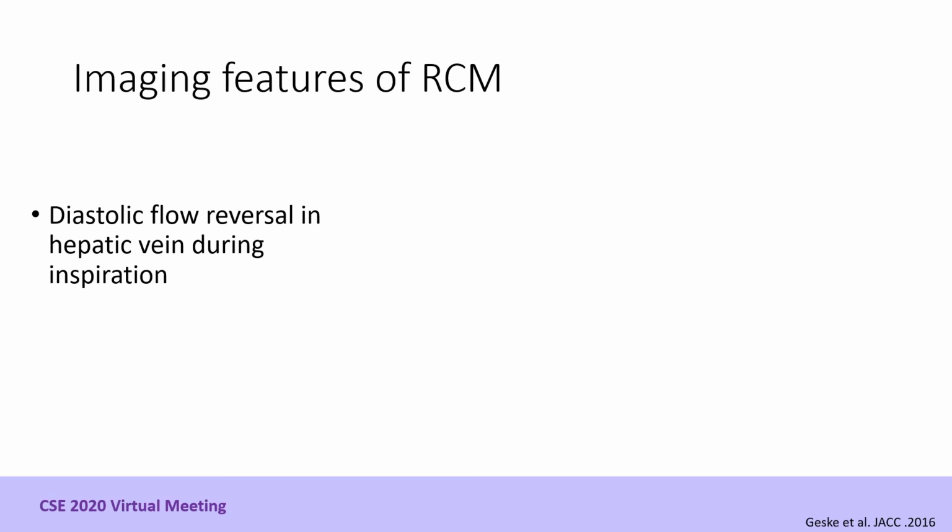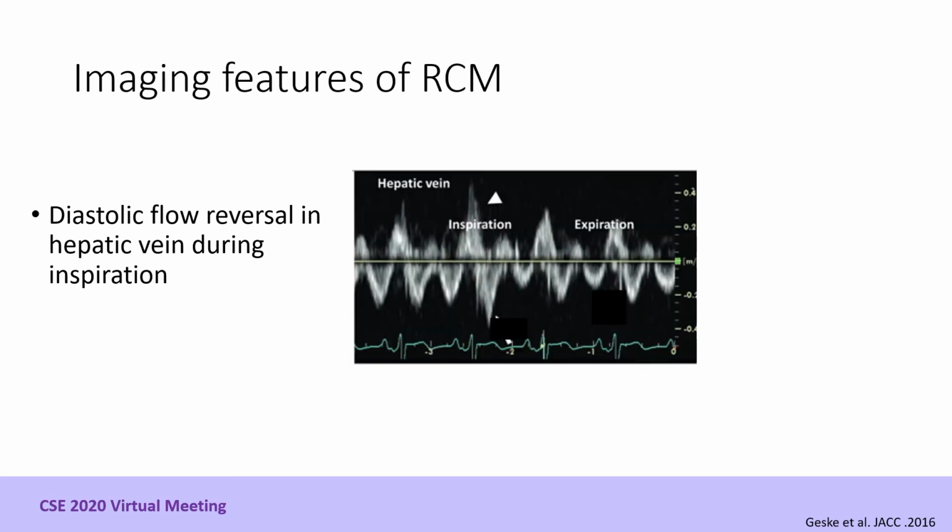Further interrogation of the hepatic vein with pulse wave Doppler identifies diastolic flow reversal during inspiration. And we can use the RICE mnemonic to remind ourselves that we expect to see the reversal in inspiration with restriction and expiration with constriction.